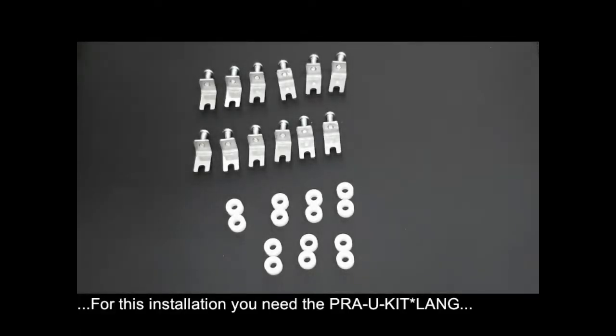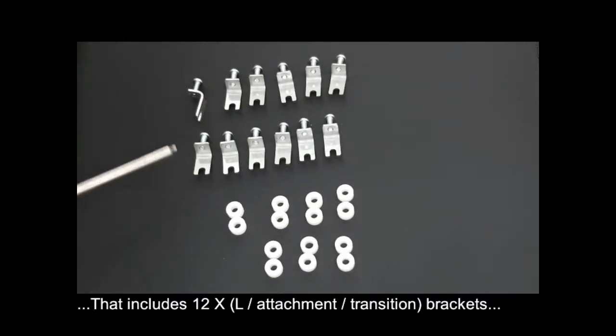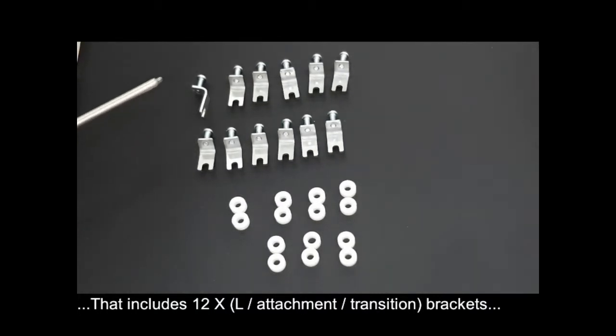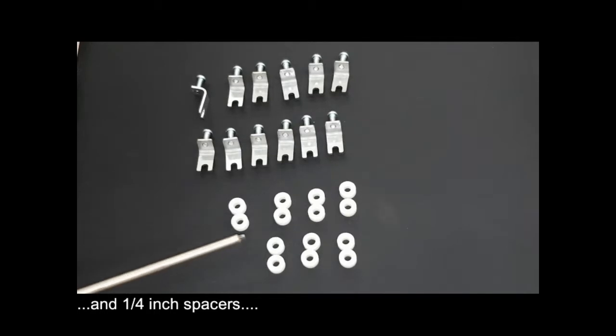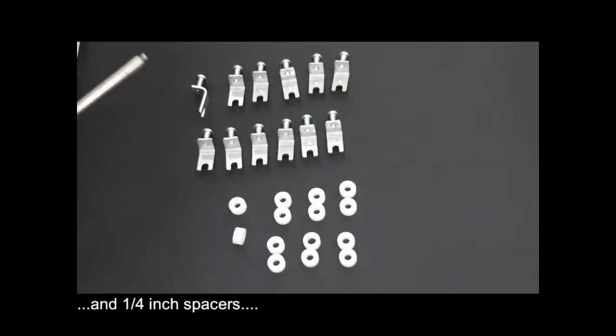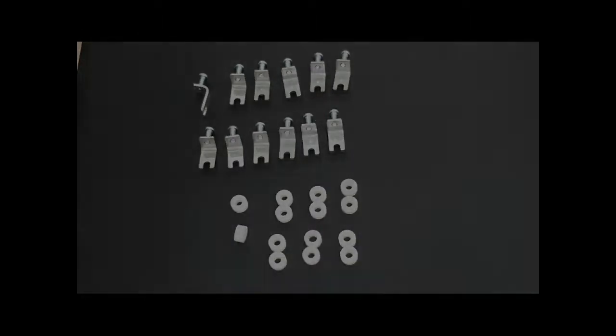Let's take a look at the kit that is supplied within the box for this type of installation. The first thing you can see is the transition bracket. They are L-shaped and can be attached to the existing bolts that are already on the wheel, and you have a screw on it which will allow us to attach the blocking disc to the wheel. You'll also have spacers, a quarter of an inch, that we will use to space in between this bracket and the blocking disc.